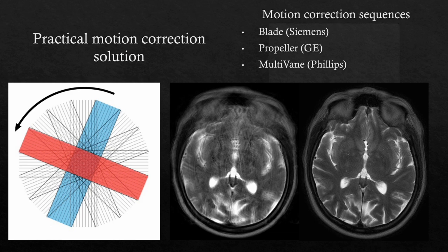Then this process continues until it's gone all the way around the rotation, and then the image is set out in k-space, and it can rearrange that data to take out any movement, smooths it out very cleverly and physically. I'm so sorry I can't explain in any more detail about that, but then we get the still image. So here on the left of the MR you get a T2 axial, and you can see then a motion corrected T2 axial on the right using the BLADE sequence.